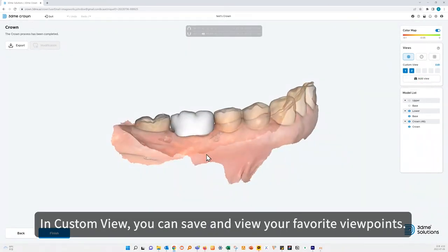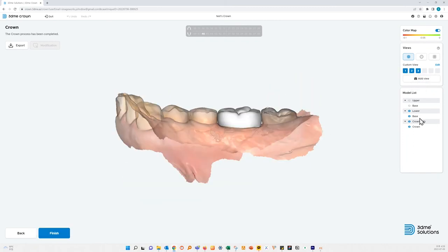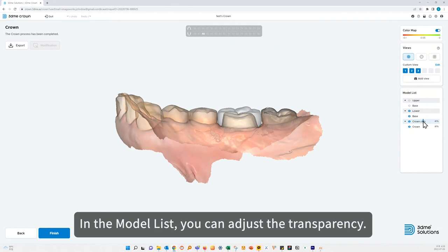In custom view, you can save and view your favorite viewpoints. In the model list, you can adjust the transparency.